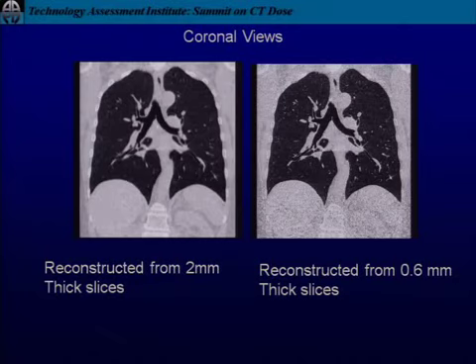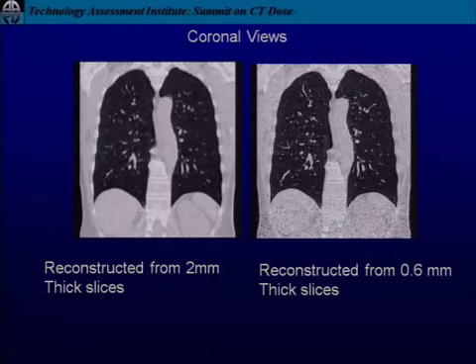Okay? But this is in the lung, right, where we have this great natural contrast between the vascular structures, the normal parenchyma, and the background. But even between the ones on the left and the ones on the right, if you were in the optometrist's office and he was saying, which would you prefer, A or B, I think you better be saying this one, right? So the anatomy is much sharper over here. Here it is at one level, here it is at a different level, and you can see, even as exquisite as the depiction of anatomy is here, it's really even sharper here. If you look in the abdomen, you can see the consequences of what we've done there as well.